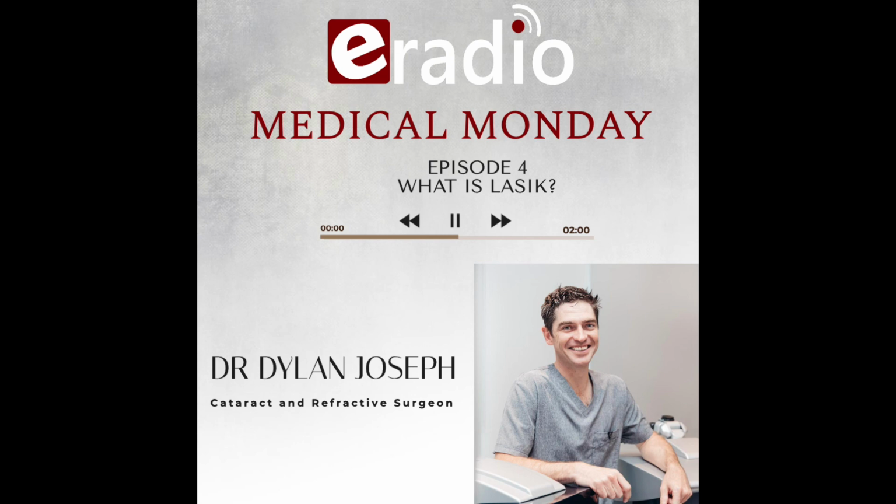That's important to remember with keratoconus. It's to improve the shape of the cornea so that you can have a better fitting contact lens or a spectacle. And then we can cross-link the cornea after that as well. So there are massive therapeutic uses, and we call that PTK, phototherapeutic keratectomy. And unfortunately, a lot of the medical aids are now looking at this as a functional rather than a cosmetic procedure. So with some motivation, we are finding that we can help people.